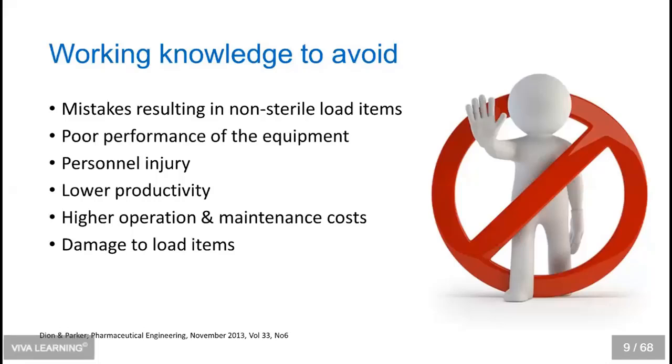When we have sterilizer issues, it can impact our productivity, so we want to make sure that we're following best practices rather than common practices. We also know that if we don't follow the appropriate maintenance schedule as outlined by the sterilizer manufacturers, that can in fact result in higher operation and maintenance cost.